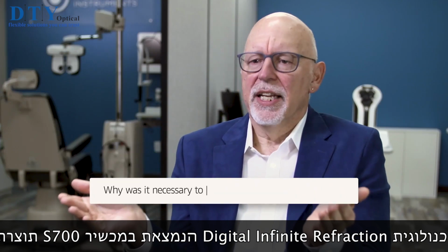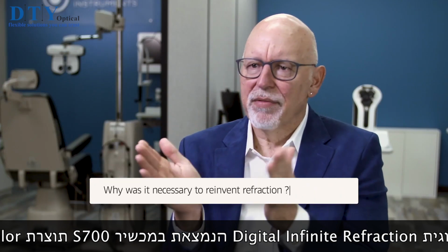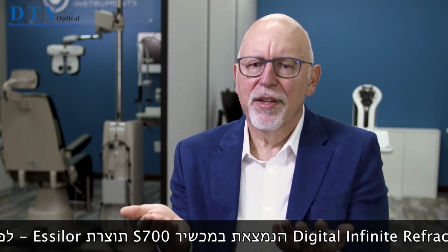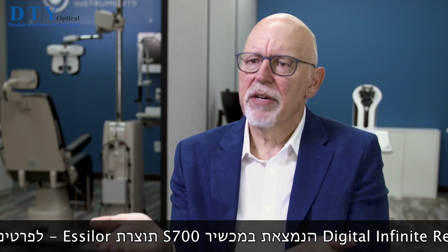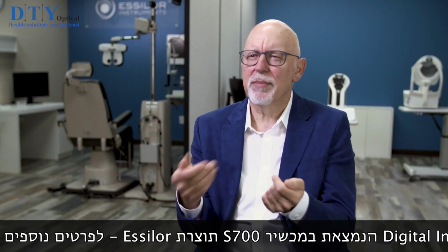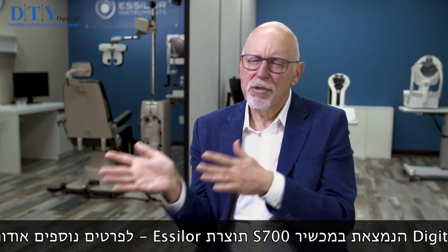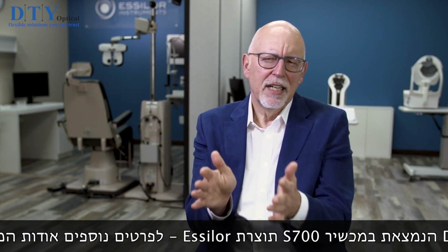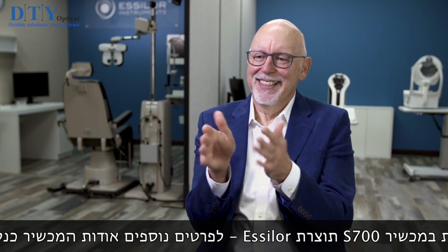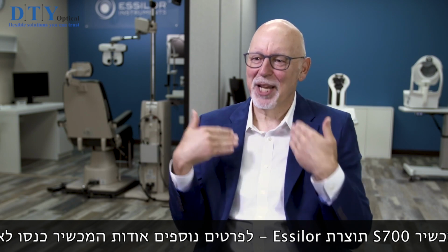What we do traditionally does have some margin for error. There's always room for improvement. A lot of the problems that we experience with patients coming back with some symptoms with their new glasses, most of those really are due to the refraction. And obviously that's a doubly subjective process.